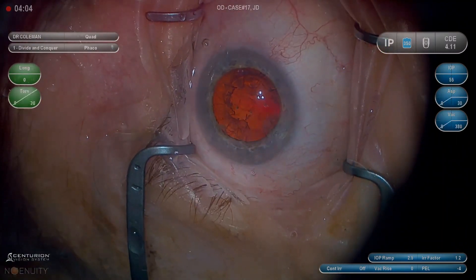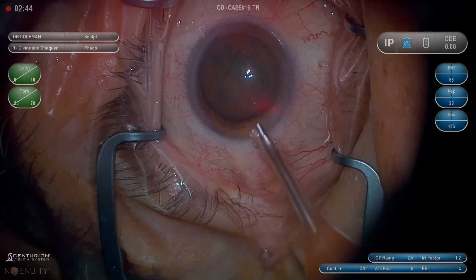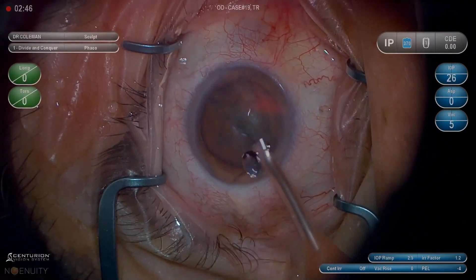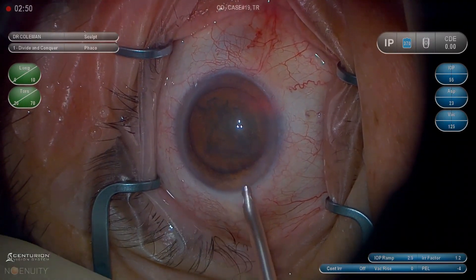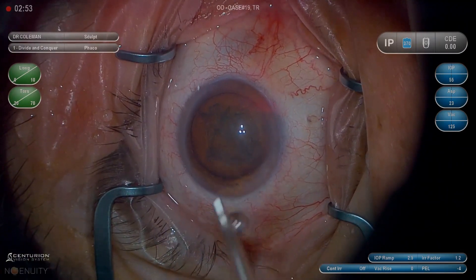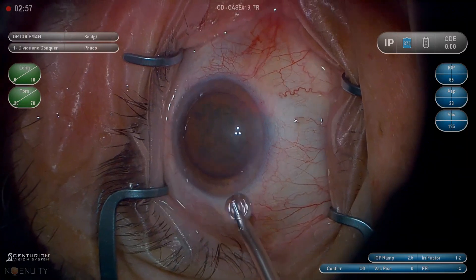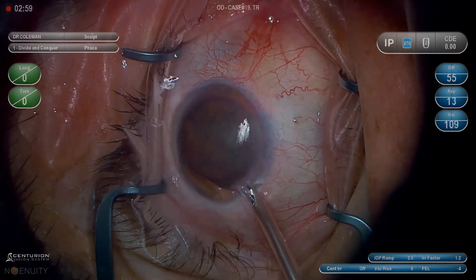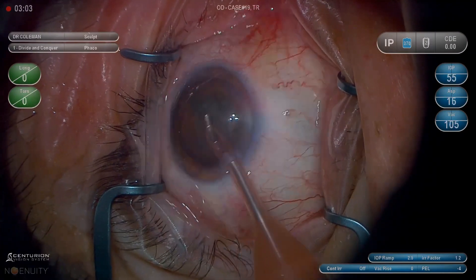I always tell our fellows and residents at LSU that there are only a couple of places you can really significantly reduce your surgical time. You can't really make incisions much faster. You can't put lenses in much faster. But you can sure vary the amount of time it takes to get the nucleus out and the cortex out — that could be 30 minutes or it could be two minutes. That's really where most of your time efficiency is going to come from.